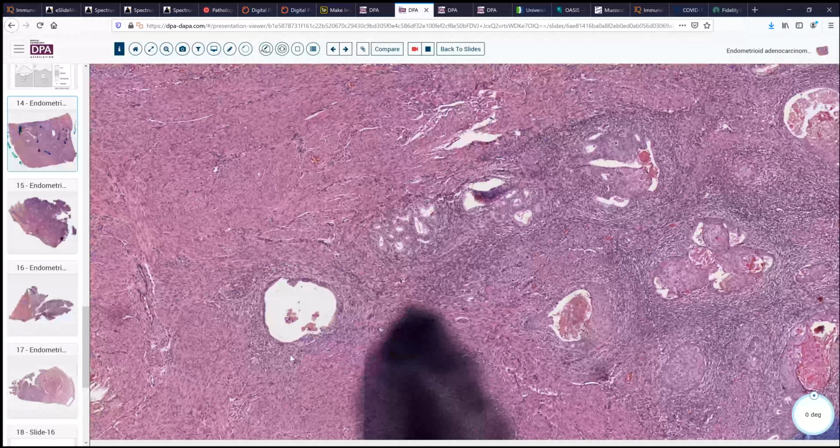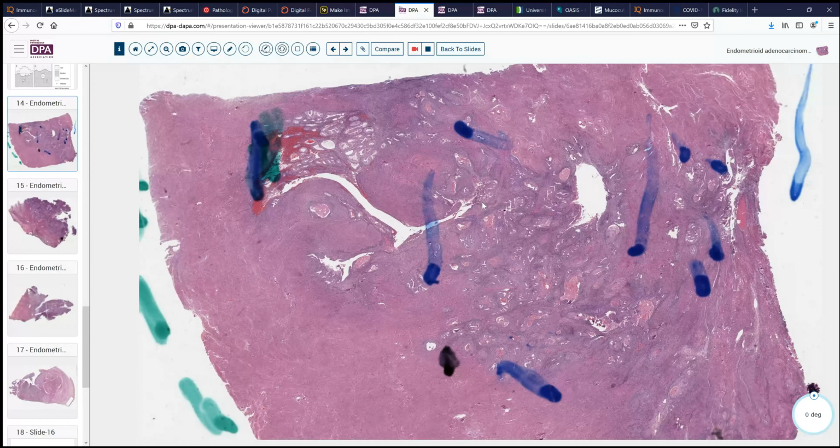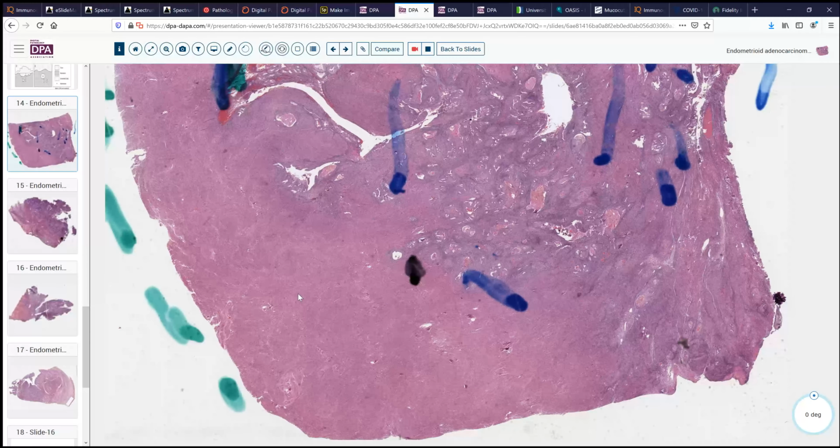Now, in addition, we also see that we have serosa out here, but we don't see the endometrial surface. We don't know where this is relative to the endometrium. Are we out in the cornu? Are we in the fundus? We cannot use this section to obtain an accurate depth of invasion, even whether it's adenomyosis or other type of involvement. And so it's important to get a nice transmural full thickness section that will illustrate the depth of invasion accurately and allow you to correctly stage it.